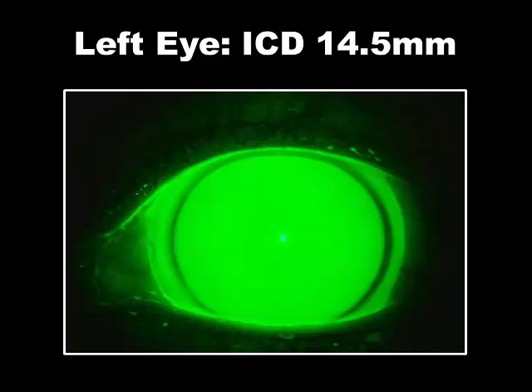Initial trial looks like the limbal clearance needs to be modified. It looks possibly a little thin. This is on insertion, so one can expect that dark ring here to deepen even more as that lens settles in. So this is a patient almost certainly needing the limbal clearance zone +5.